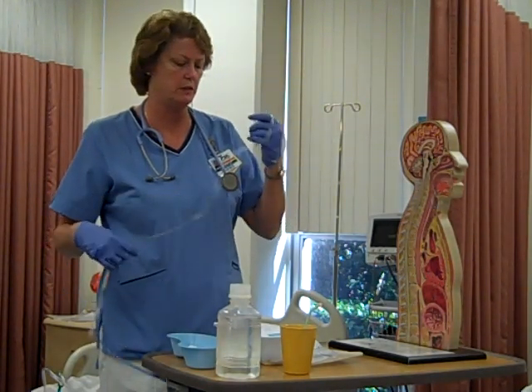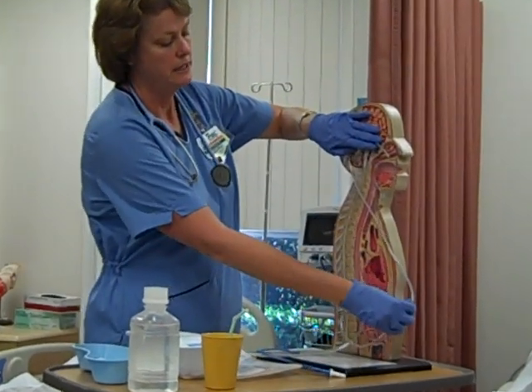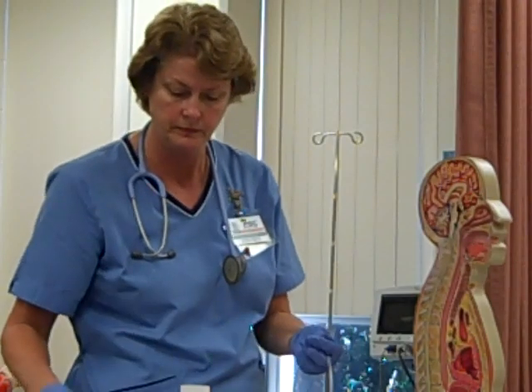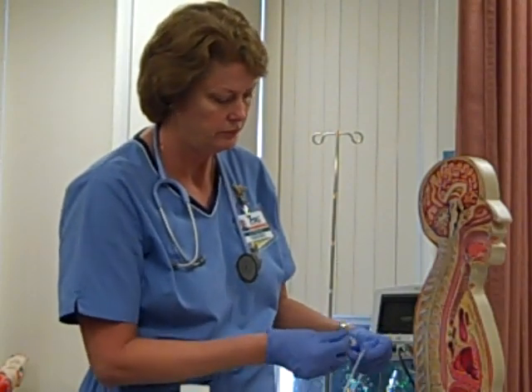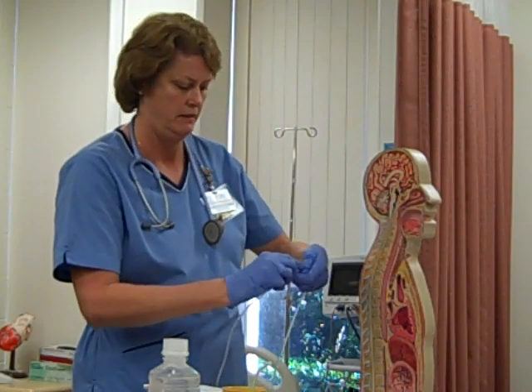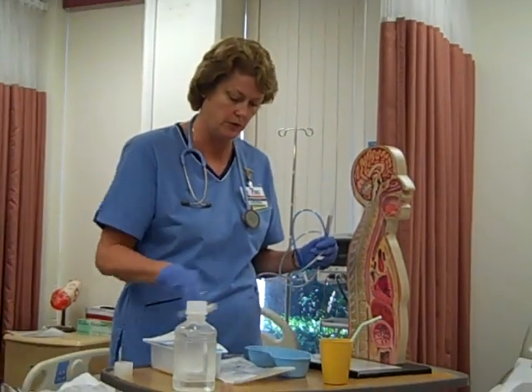We want to measure from the nose to the ear, and then go down to the xiphoid process. Once you get that measurement, use a little piece of tape and mark that on your tube so you'll know how far you're going in. We'll mark our tube. We'll need lots of lubricant. We've got our water handy, and I would have another person with me — it's much easier to do this when you have another set of hands.